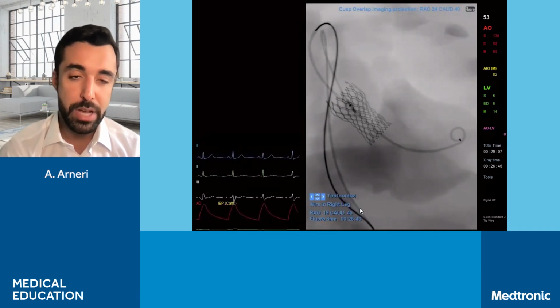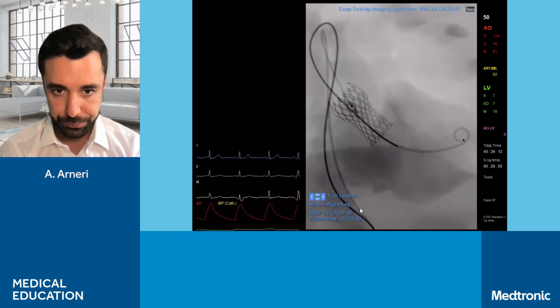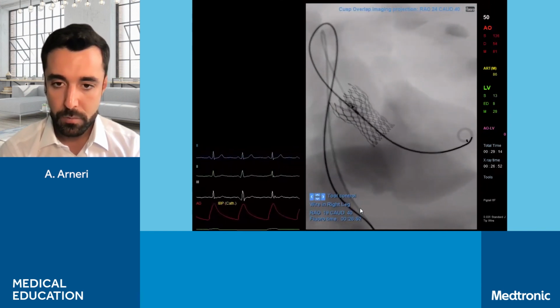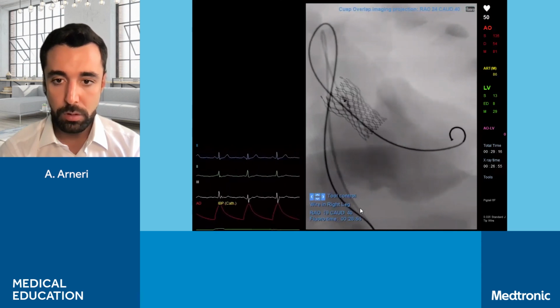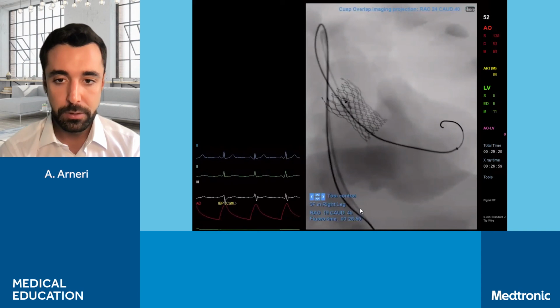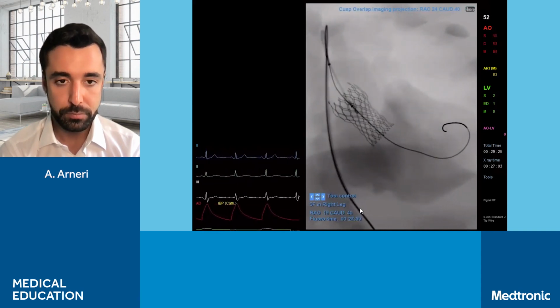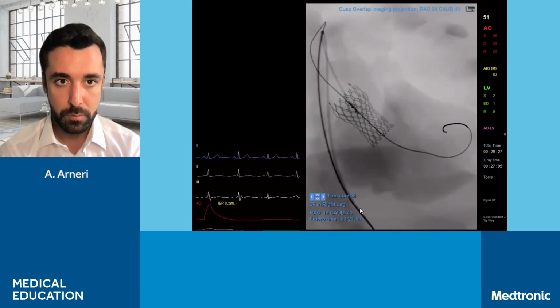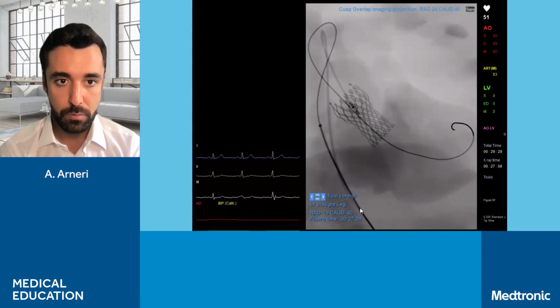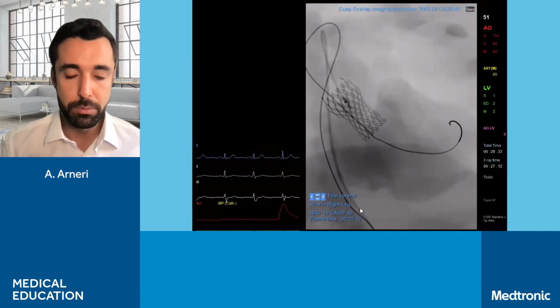It's always better every time we move our catheters to do that over a wire. And now we are pulling back first the pigtail and afterwards the J-tip wire. Okay, and now we also pull back the J-tip wire.